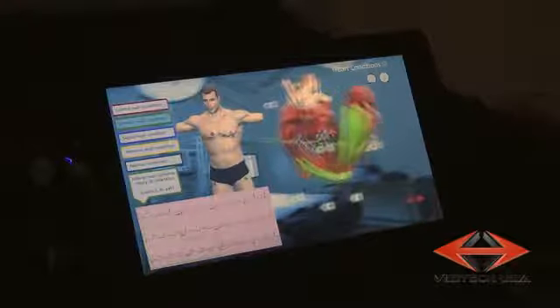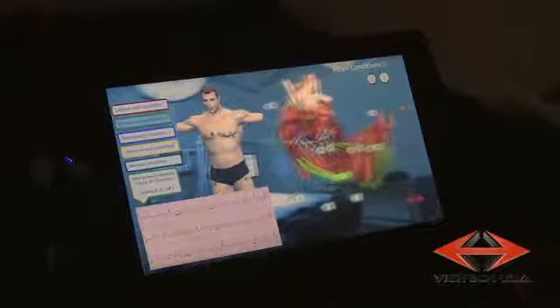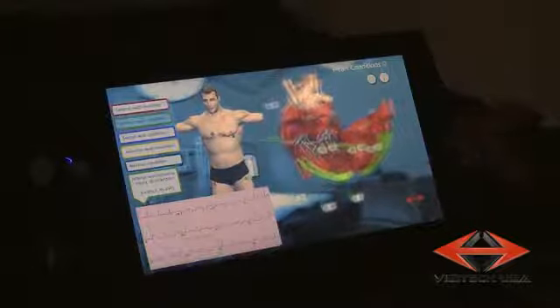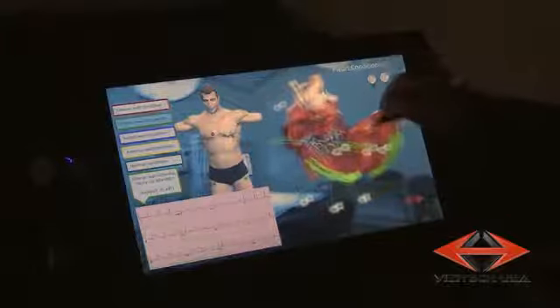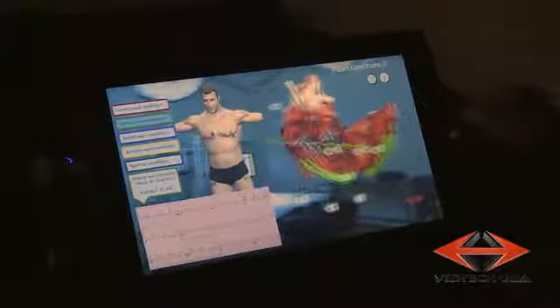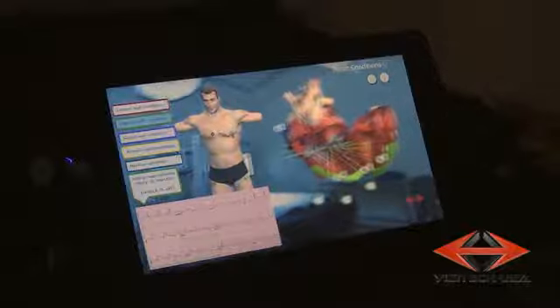Again, if we open up the heart, we can see that there's a region of the heart that's being measured explicitly by the combination of those 3 leads. Now, those leads show you that the specific electrodes that comprise that measurement are on the upper right arm, the upper left arm, the lower left leg, and that's showing you how these are actually being measured by electrode. But again, the lead is the measurement vector that goes through the heart itself.